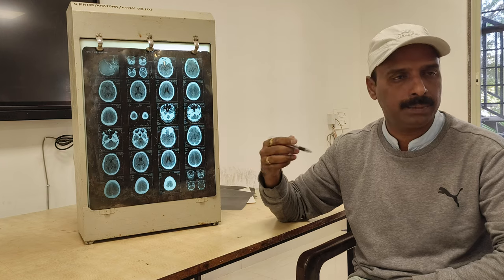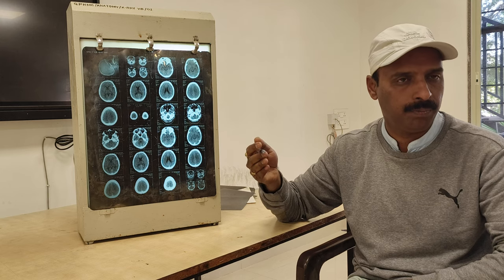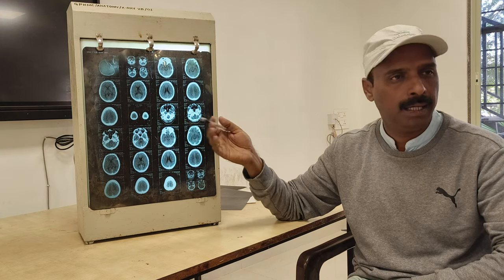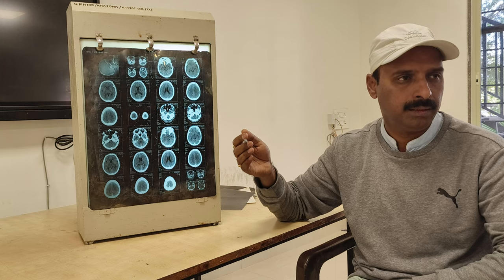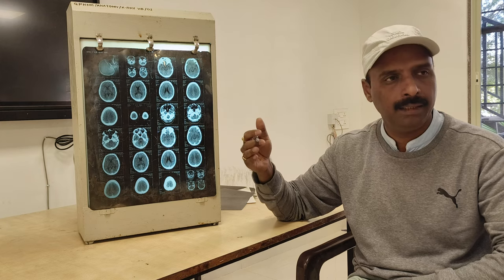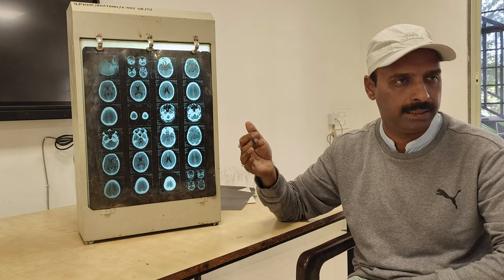Then again, we have the special types: we have the MRI, we have the PET scan, which nowadays we advise to find out cancer and so on. PET scan is an advanced technique. Then we have the MRI, magnetic resonance imaging. So MRI, and afterwards we have the PET scan.